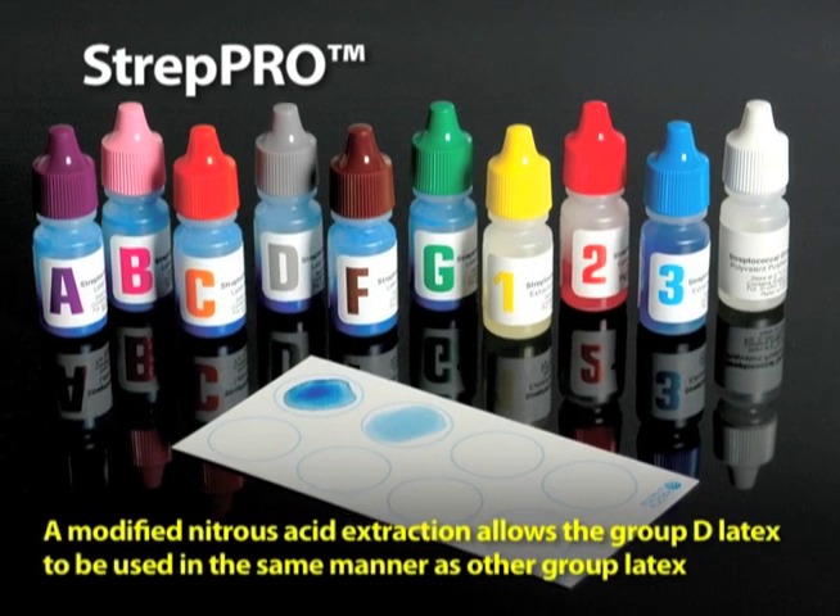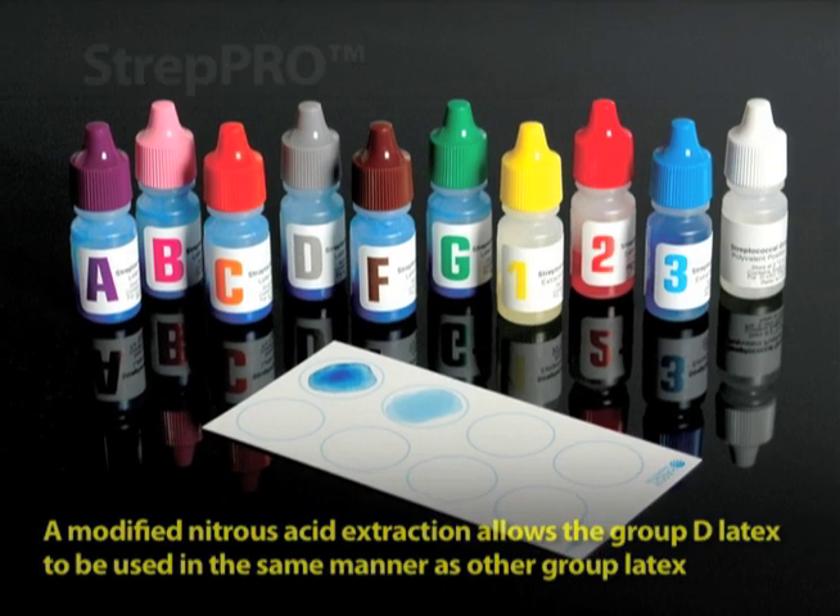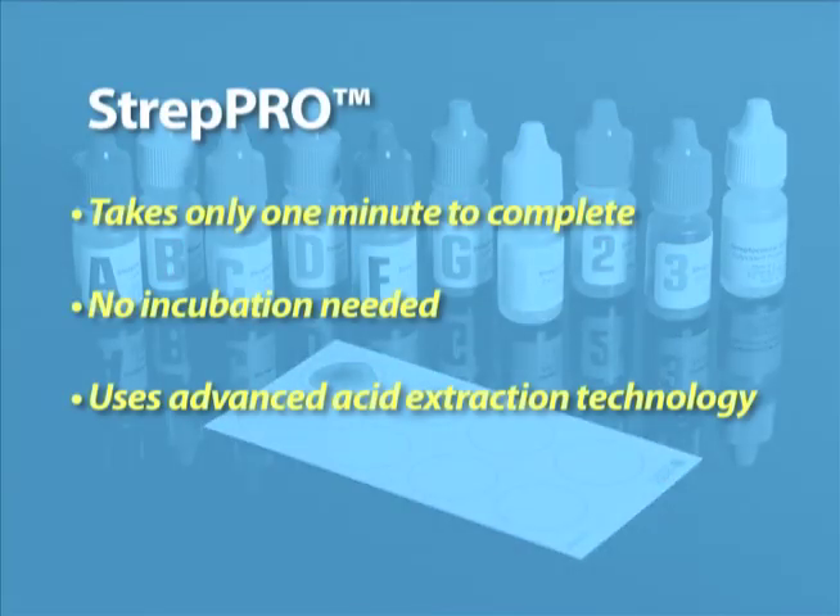Please note that it is one of the few kits on the market today that will identify group D. Strep Pro takes only one minute to complete. No incubation is needed. It uses an advanced acid extraction technology for rapid results.